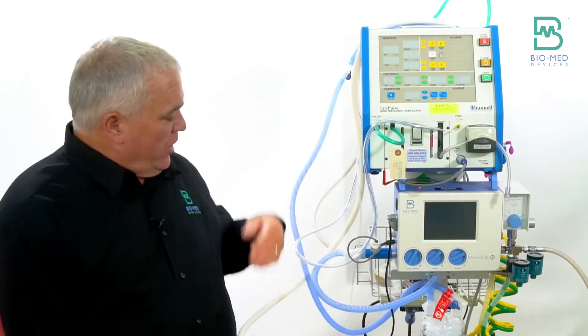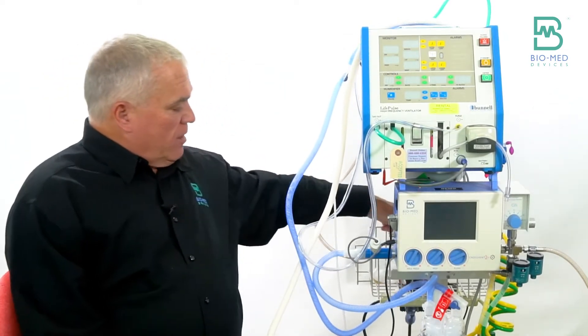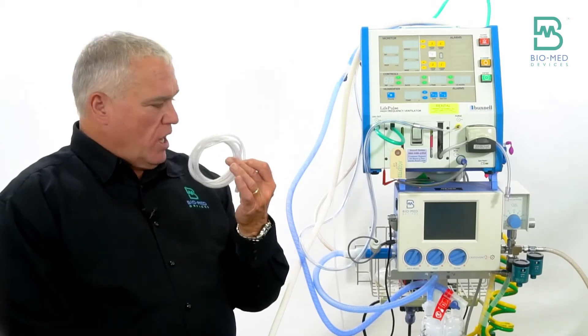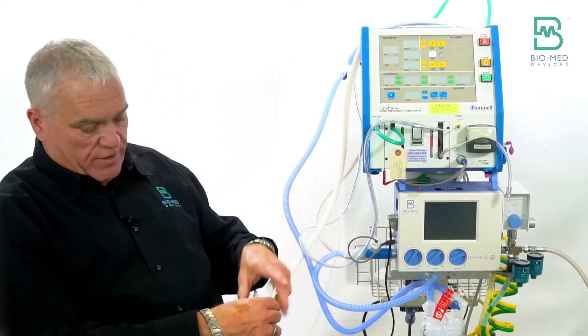The next thing we're going to use is the circuit comes with a pressure line. Normally you don't need that pressure line with your ICU vent, but you will with the Crossvent.